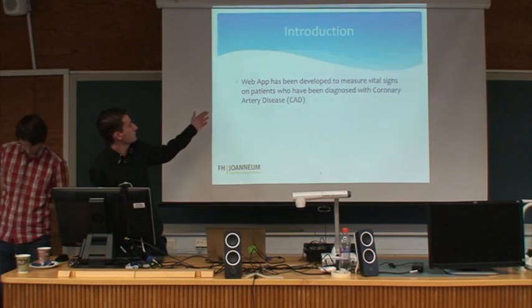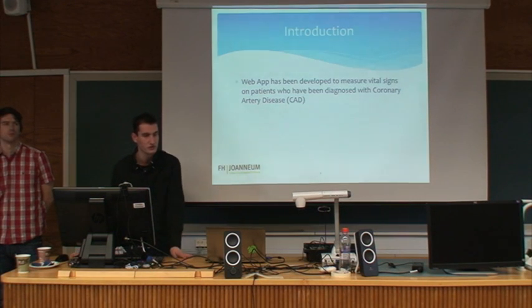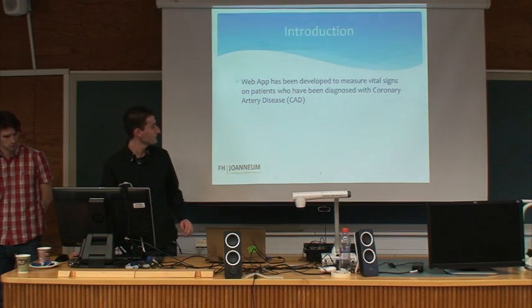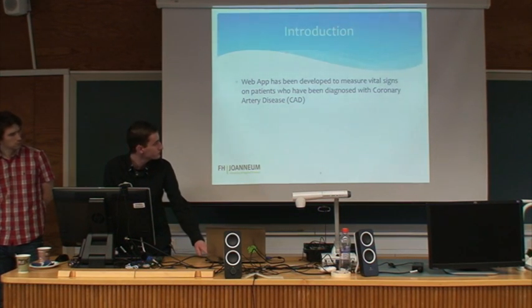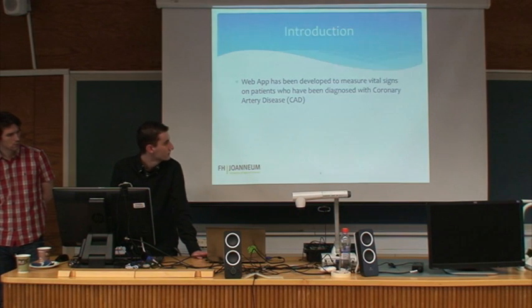First, we want to create the sensors. We want to show it on the screen, because if you show it, it's always good to see. So we created the web app to see all the information. We try to give graphs and an overview so you can see if there's a patient and if there's something wrong.